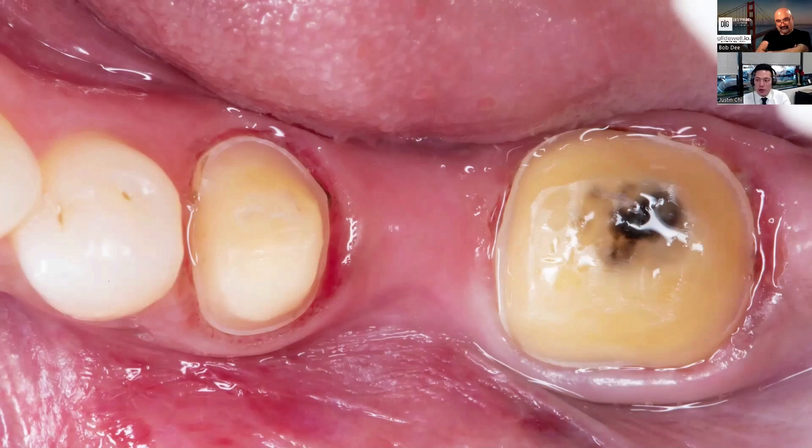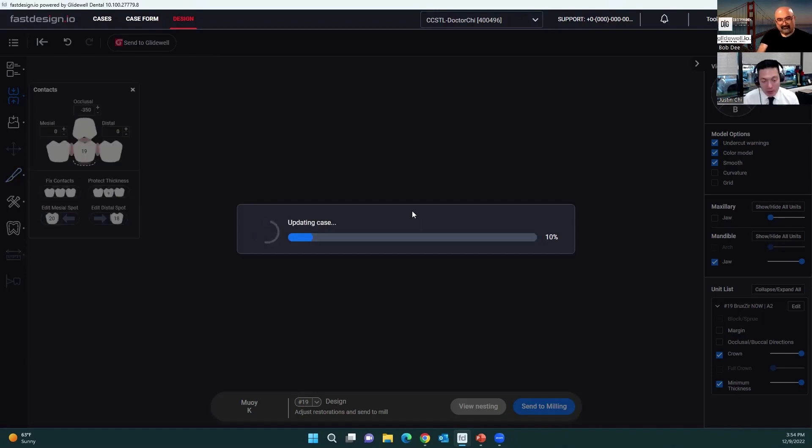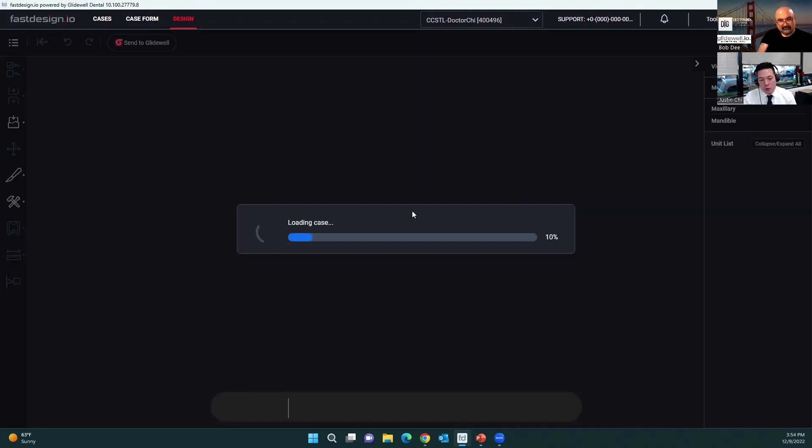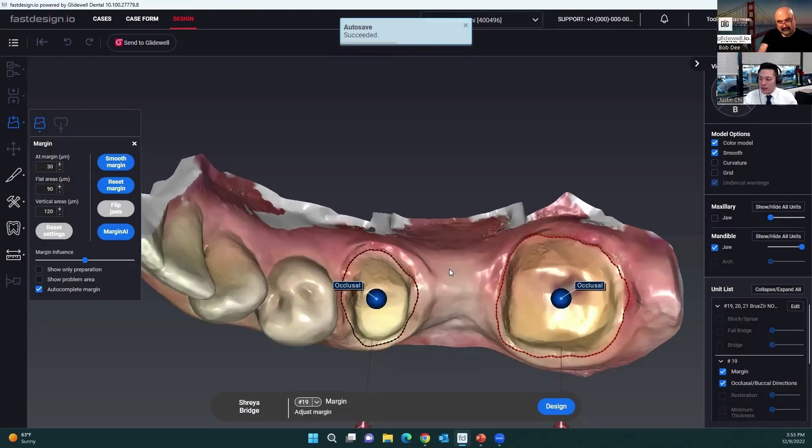Fortunately, we were able to get the preparation done and designed. I want to take you through what the design process looks like for a bridge. You might think it's really challenging, more difficult than a single unit — there's obviously more to consider. You've got double the margins and connector areas between the abutments and the pontic.